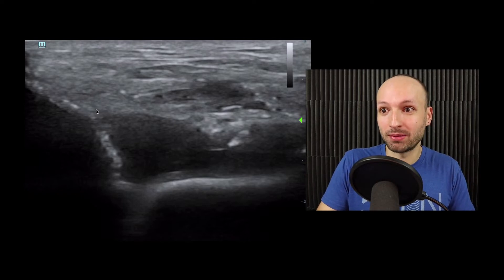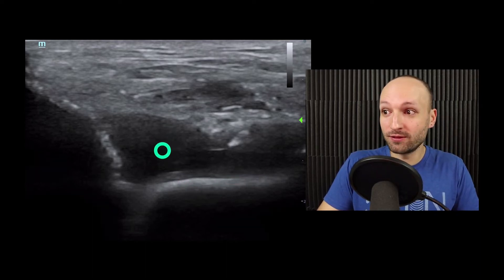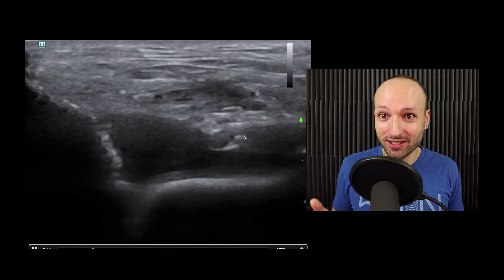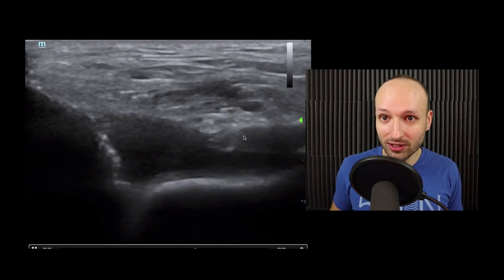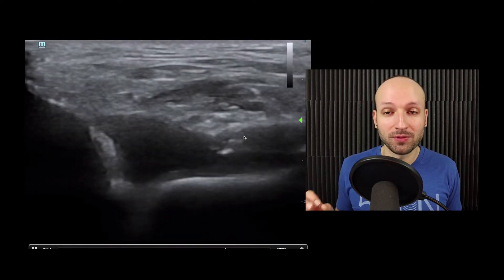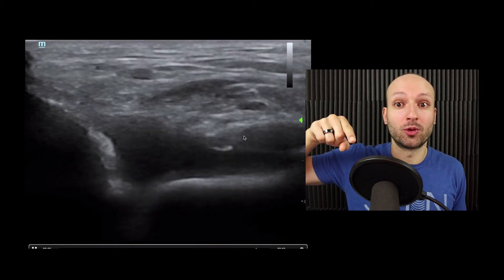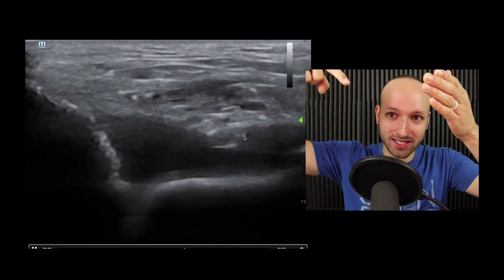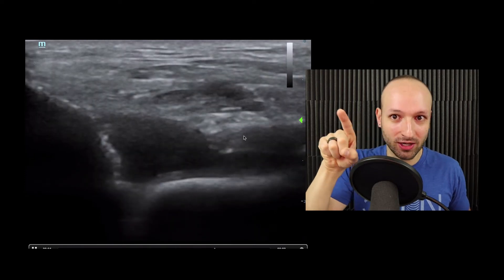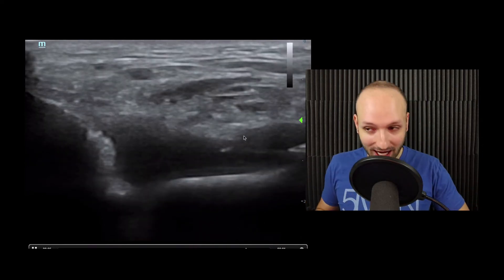This is an ankle effusion tap. Right here is probably the tibia, and right here is probably the talus, and this is an ankle effusion. Here is that needle going right into that ankle effusion. We can do taps — hip taps, knees, ankles — and I would suggest doing these all with ultrasound because it is significantly more accurate. Just like with ultrasound-guided IVs versus landmarks, with ultrasound you know exactly the path — it's a straight line. With these arthrocenteses, you're not poking around; you can directly visualize that fluid and make sure the needle goes directly inside it.